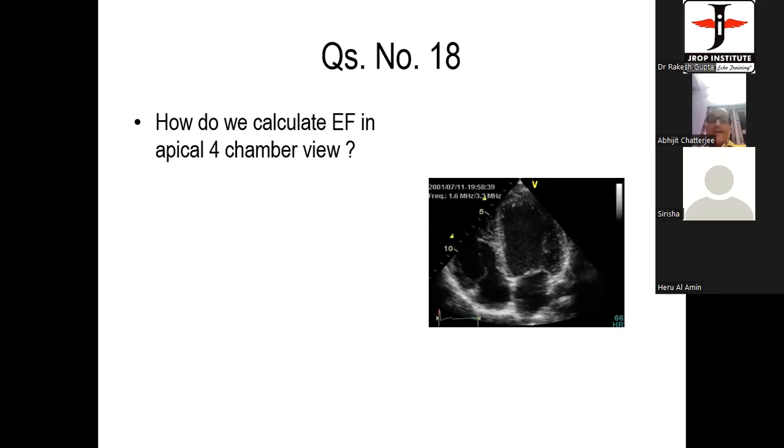How will you prove that? You say this is dilated, but how will you prove that? What will you do next? We keep M mode, sir. No, this is 2D. I won't allow you to use the M mode. M mode is not good, you see. Okay, sir.